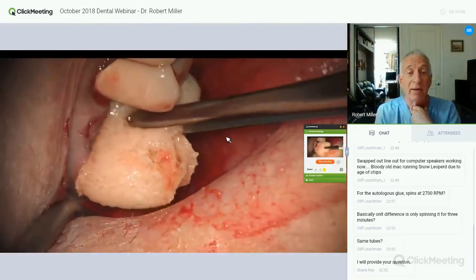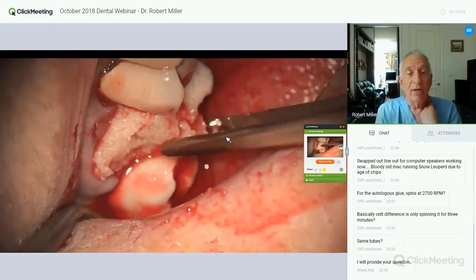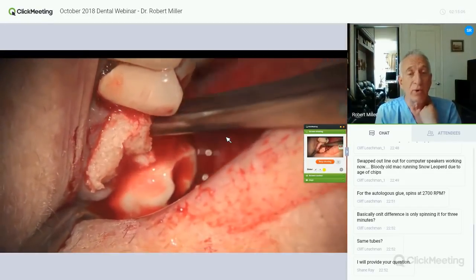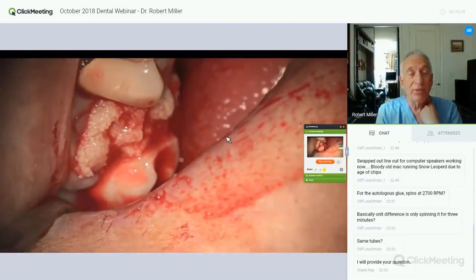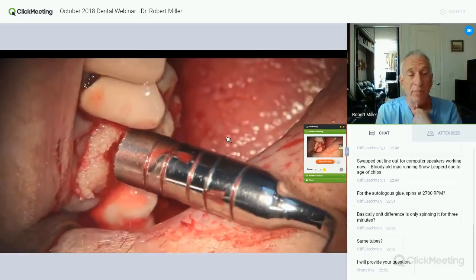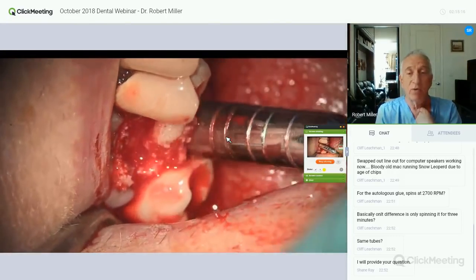Now here is the fibrin complex with the osteolive. Note that it's not true particulate anymore. It's got a fibrin base to it. It's much easier to handle. You can bring the whole complex to that, and it doesn't extravasate like individual particles do.